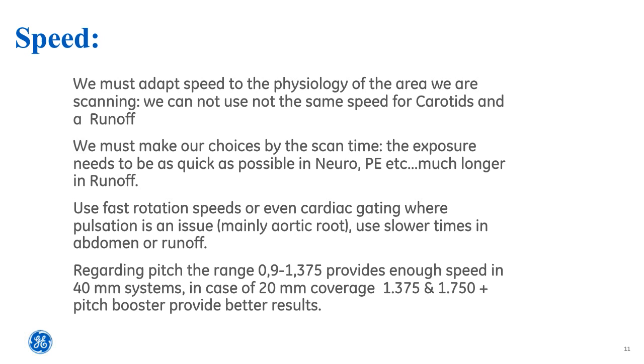So in neuro, we need to have a really quick scan time, and we need a far longer scan time for a peripheral runoff, because obviously the contrast is going to take longer to get to the distal area of the limbs.